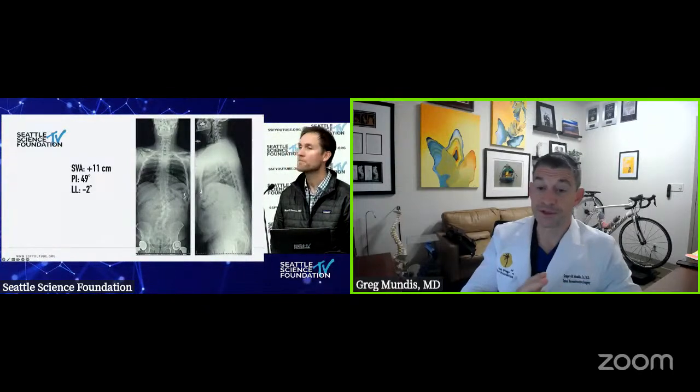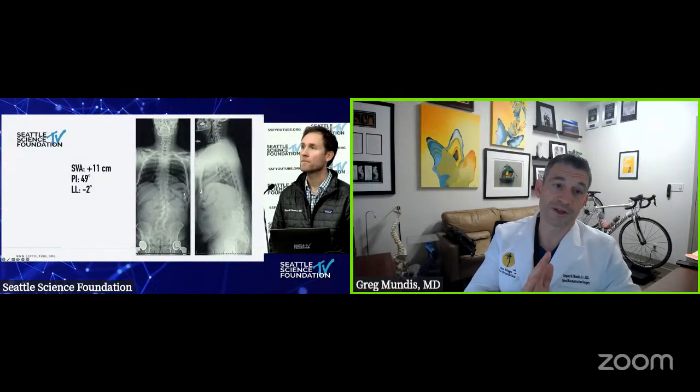The other thing that's interesting on him is if you look at his pelvic tilt, it's elevated, but it's not 30. It's probably 20, 25, something like that. And for your pelvic tilt being your primary mechanism for compensation, one of the reasons he's decompensating is probably because he's got so much stenosis, right? So he's probably having to keep his back in some flexion just to try to get some relief from his stenosis. So he's probably not even retroverting as much as you would typically.